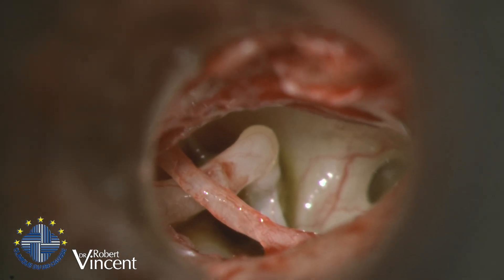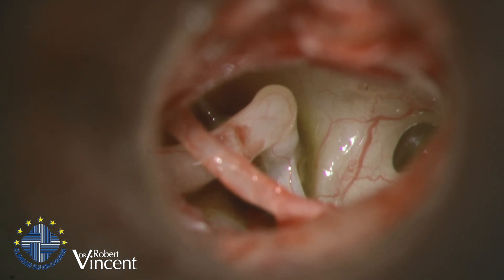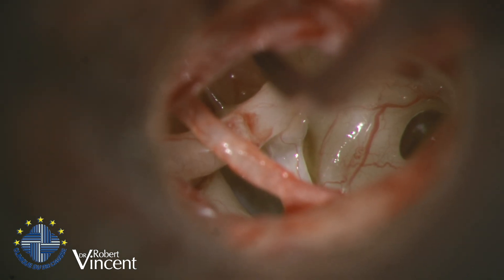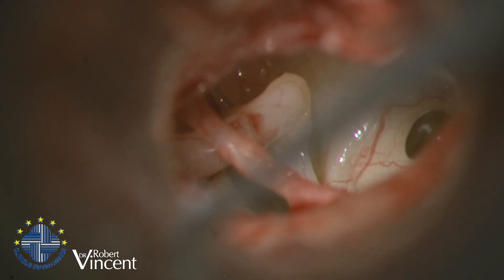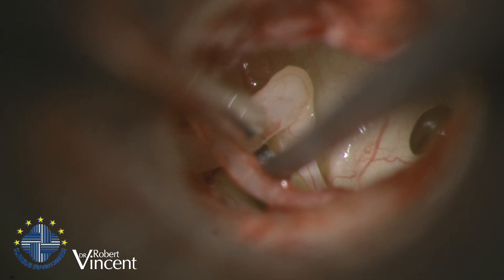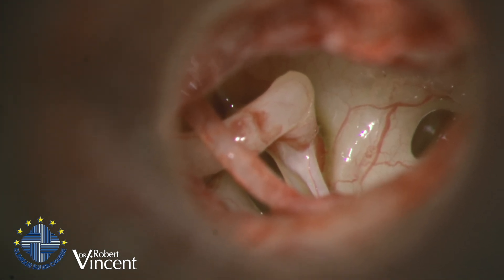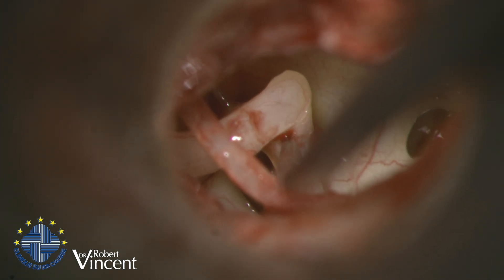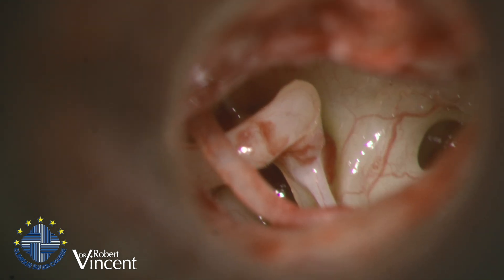I will now check the ossicular chain mobility, but first I need to separate the incus from the stapes. We are going to test the mobility of the ossicles — for that we need to separate the incus from the stapes. You can see that if I move the malleus, the incus is moving. Using the joint knife, I pull a little bit on the incus so I can see the position of the incudostapedial joint. We can see a very strongly fixed stapes.